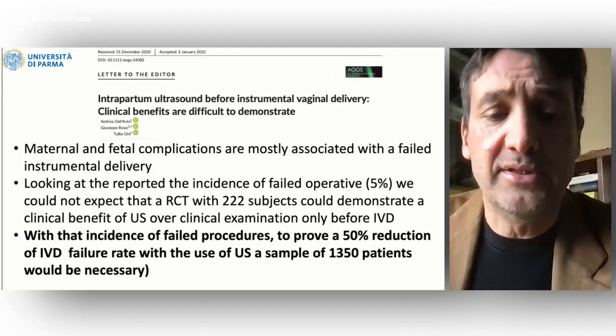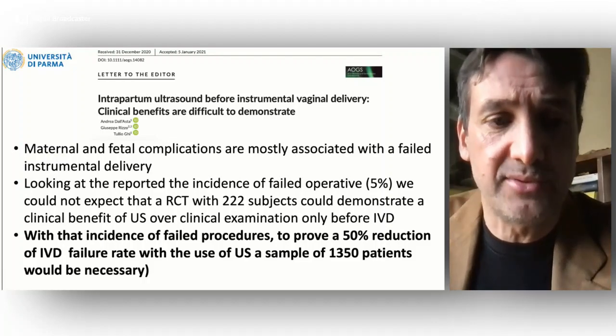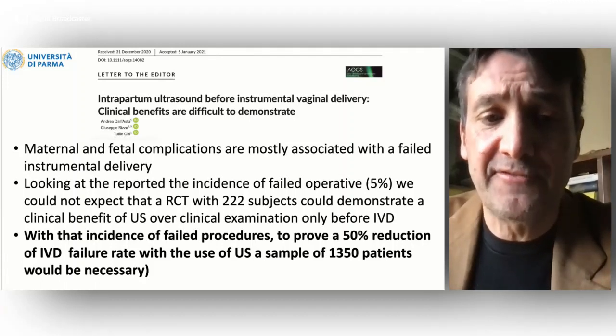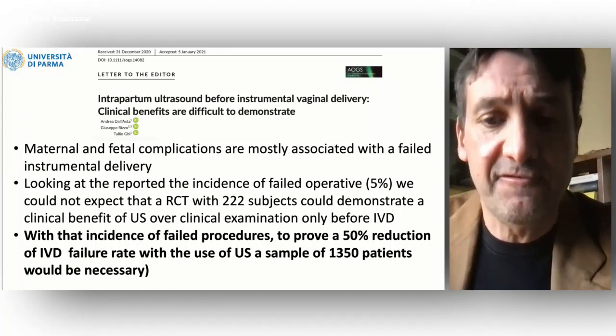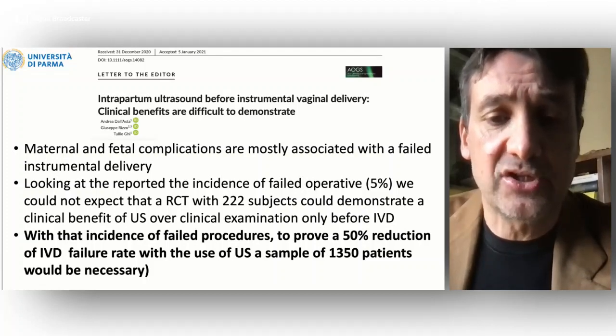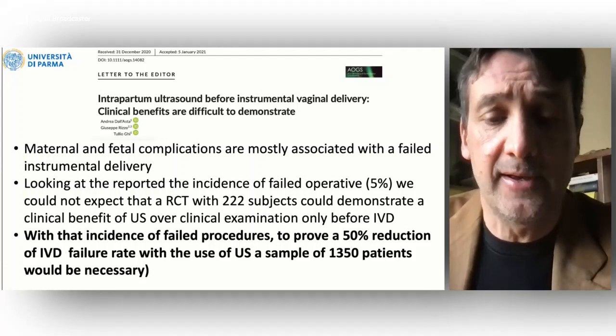But with the 222 patients that were enrolled in the study, we could not demonstrate a benefit of ultrasound, due to the fact that the incidence of failed instrumental vaginal delivery and the incidence of complications for the mother or for the baby, fortunately, is very low. To prove a difference, we need thousands of patients, and actually the studies that have been published so far have not reached such a power.